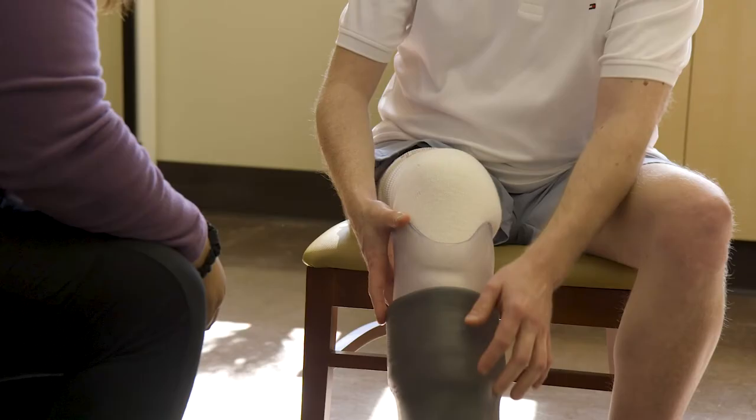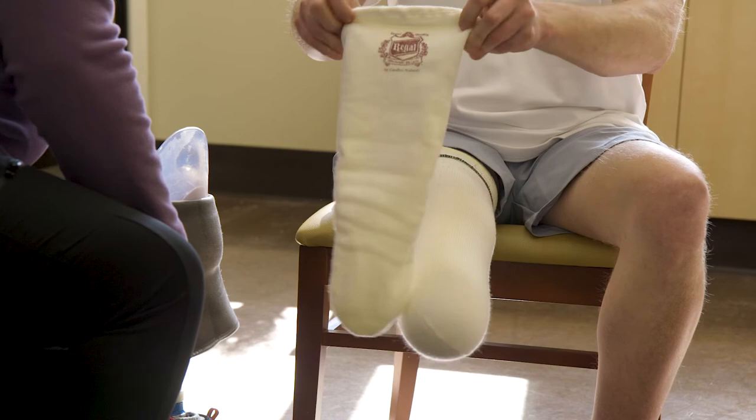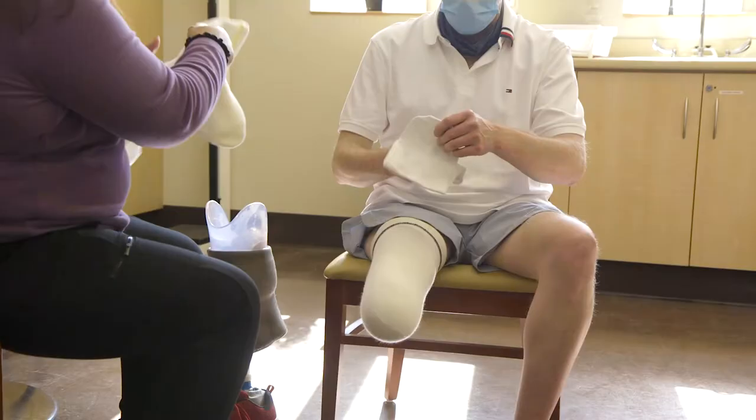Adjust socks to get the right fit. The best way to find the right fit is to add or take away one single layer at a time. This may mean you will have to switch socks to find the right fit and the right level of thickness.